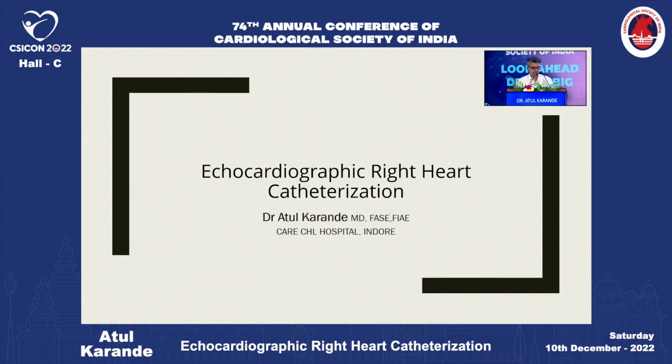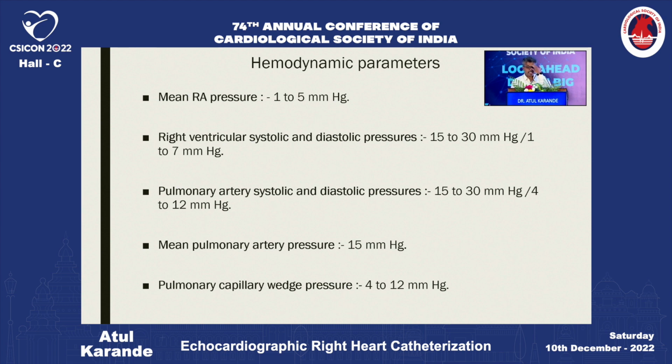Yes, good morning again. Now another topic, echocardiographic right heart catheterization. Right heart catheterization is an invasive hemodynamic procedure that directly measures the cardiac pressures and calculates the cardiac output. With the help of right heart catheterization, we measure these hemodynamic parameters, and normal values are also mentioned here.